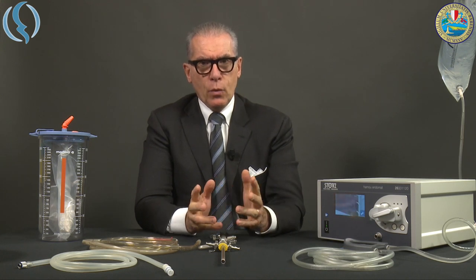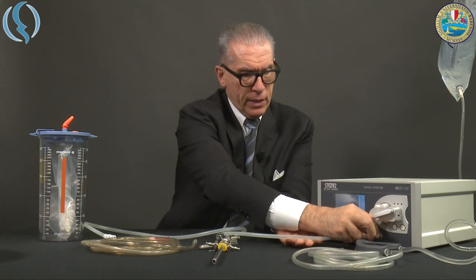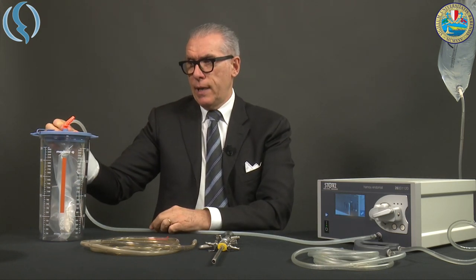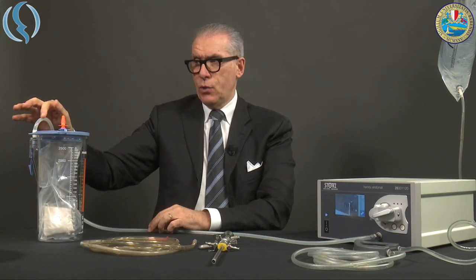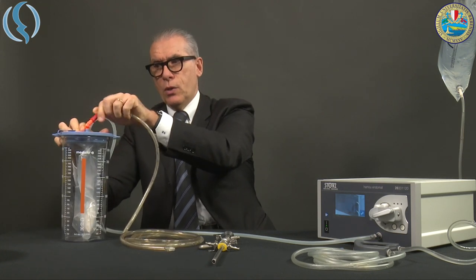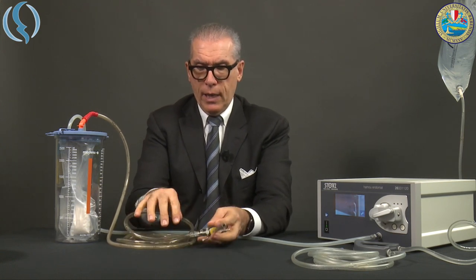We install first the aspiration tube, or vacuum tube, which is characterized by a different lock — so you cannot use the one from the old AMU, you have to use the one that comes with the new version. We insert the aspiration tube into the vacuum, and then the second aspiration tube that goes from the vacuum to the resectoscope, in order to establish the aspiration.